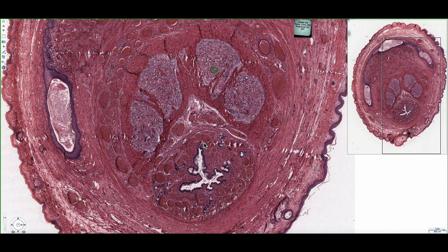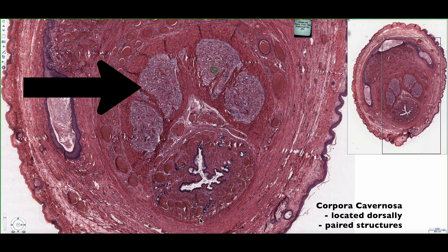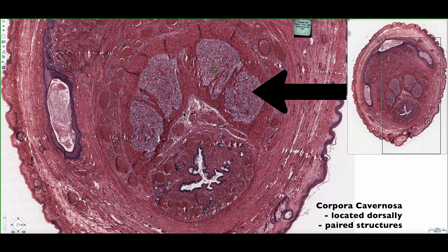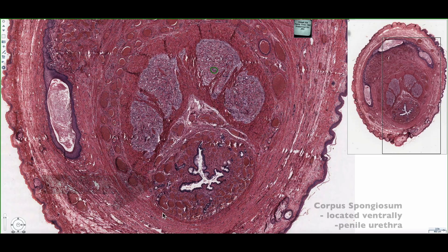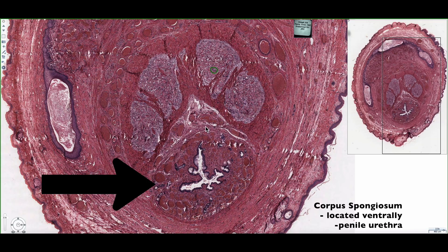This is a tissue section of a human penis. If we look at the center of the section we can see three erectile tissue masses. On the dorsal surface we'll find two paired structures — this is our corpus cavernosum — and in the midline on the ventral surface this is where we find the corpus spongiosum, which is where we're going to find our penile urethra.